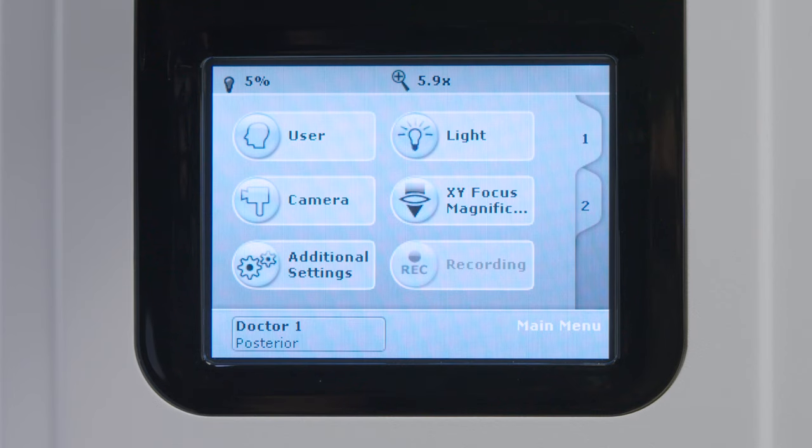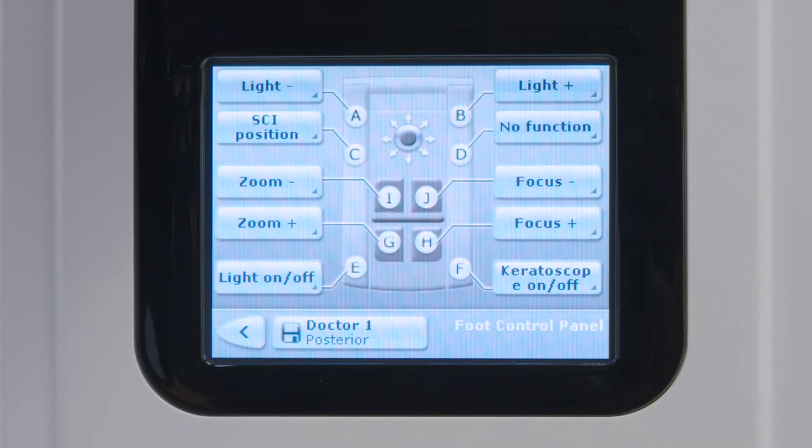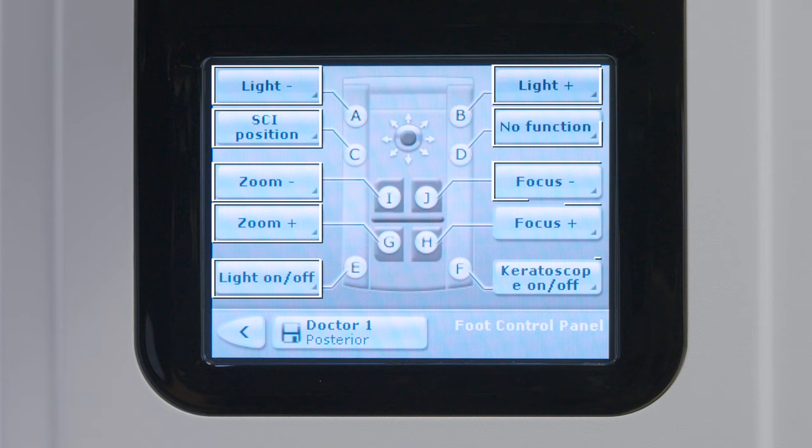Next, configure the foot control preferences. From the main touchscreen, select the Additional Settings icon and then select the foot control panel icon to view the foot control panel configuration screen. On the configuration screen, the foot control panel icon has 10 function switches pointing to it that indicate the current programmed functions.